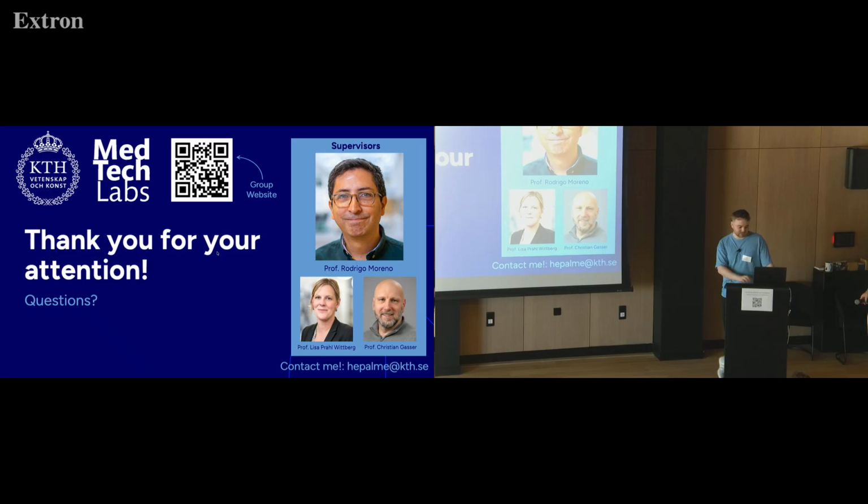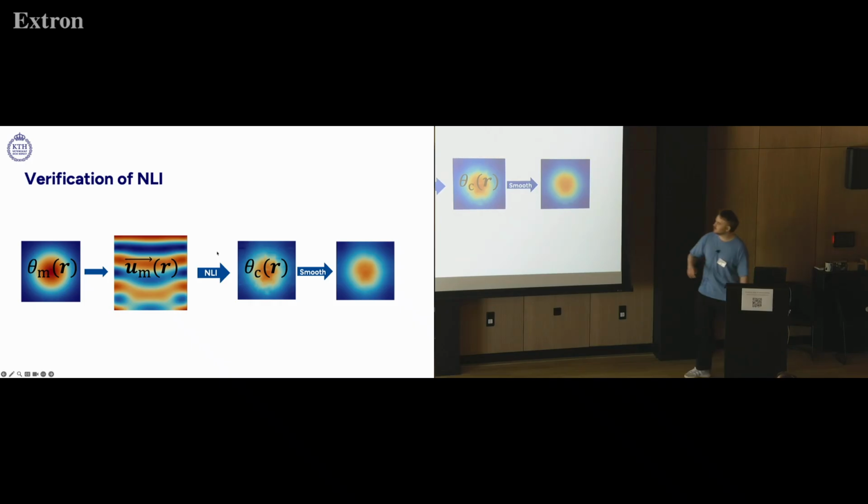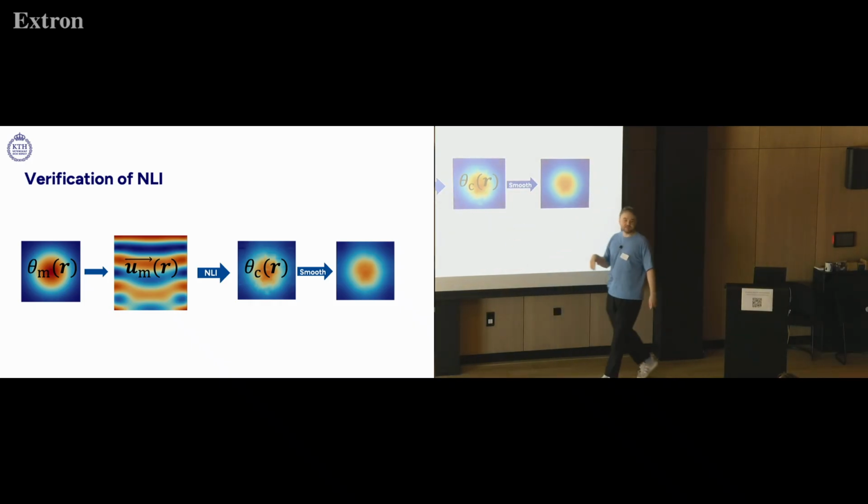You can see it if you look here, it's a little bit patchy. We have looked at Tikhonov and total variation regularization, which works, but the implementation becomes so much more complicated that I don't know if it's worth it. But if you want to work on it with me, then you know.